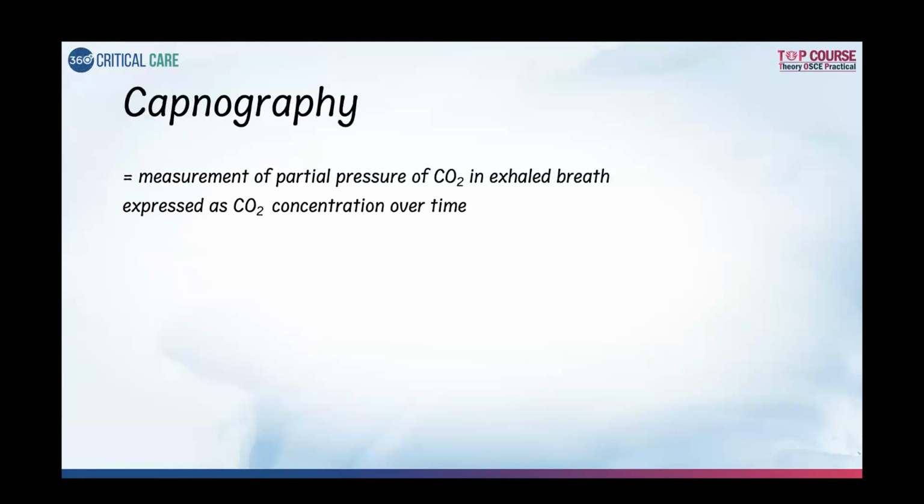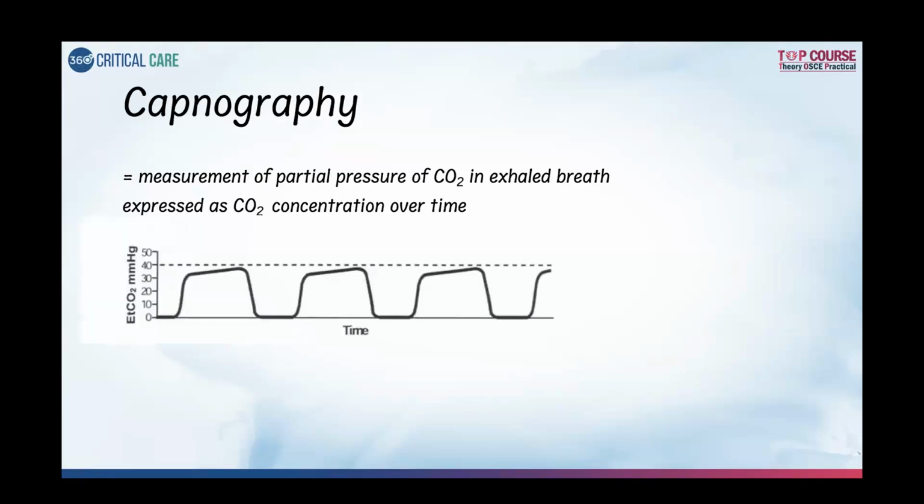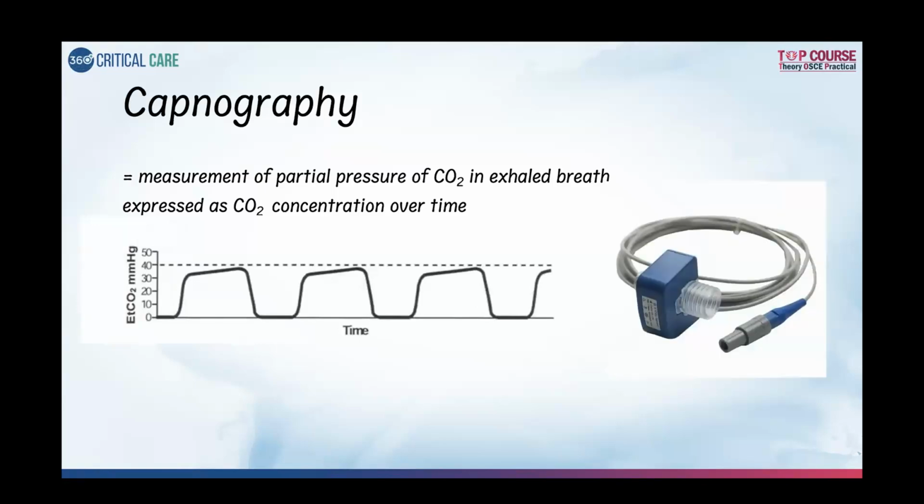Well, first of all, capnography. I know you are all masters in capnography, and in the exam, you may or may not get one of these, but these are the things that you think you are very confident of, and then start struggling when questions are asked. So, capnography is a measurement of partial pressure of carbon dioxide in the exhaled breath, that we know, and it is plotted against time. And there are two types of capnometer that you know already, so I'll not go into detail about it.